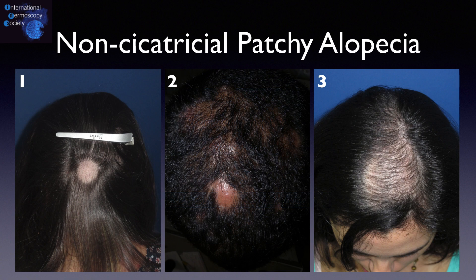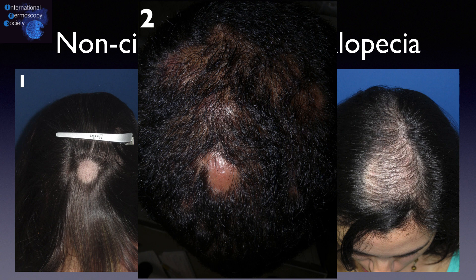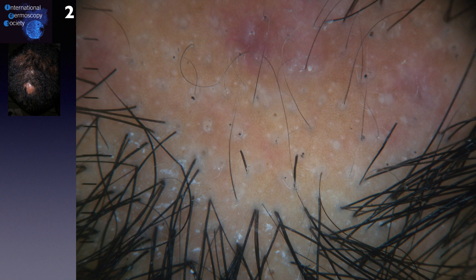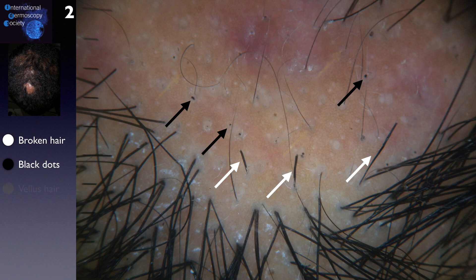In the second case, we have a patch alopecia in a black scalp. From trichoscopy, we can see many broken hairs and black dots. There are some vellous hairs and a reddish area in the center, resembling an inflammatory acne.